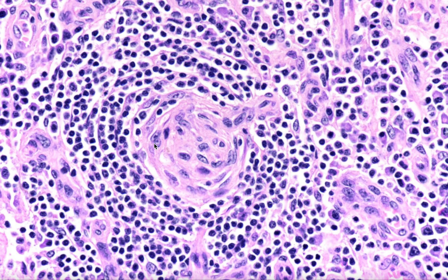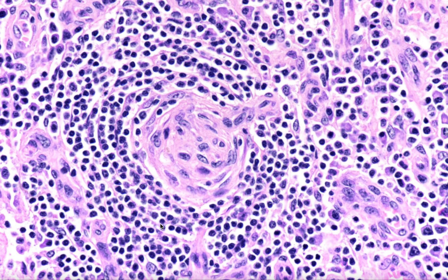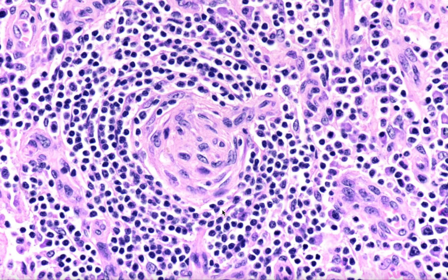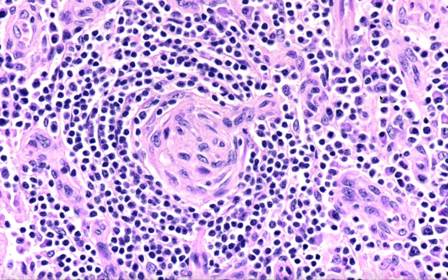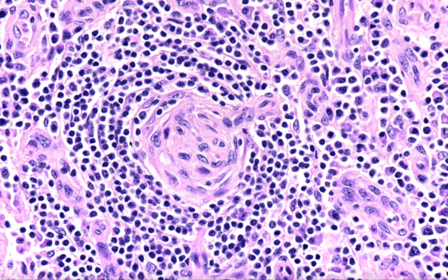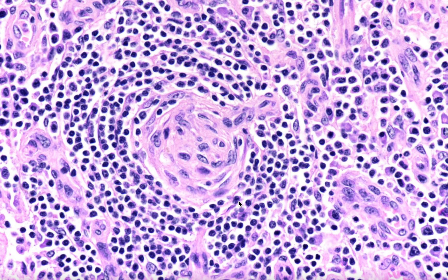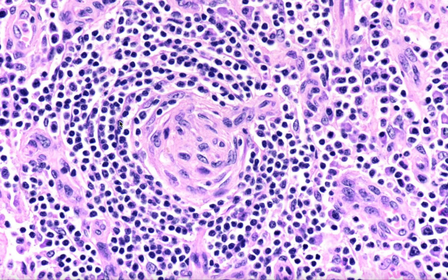This is very rare, but can happen. Other associations include EBV co-infection, HIV, plasmablastic lymphoma, and primary effusion lymphoma, which can in rare instances be associated with these rare regressed germinal centers that you can see in lymph nodes.